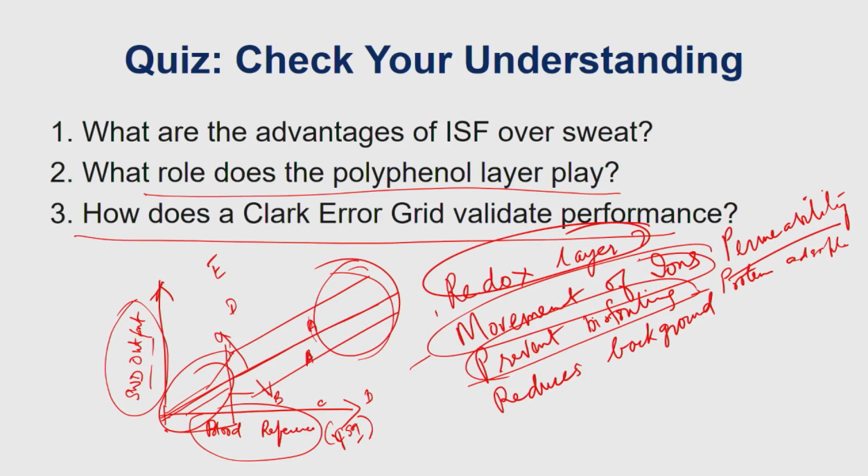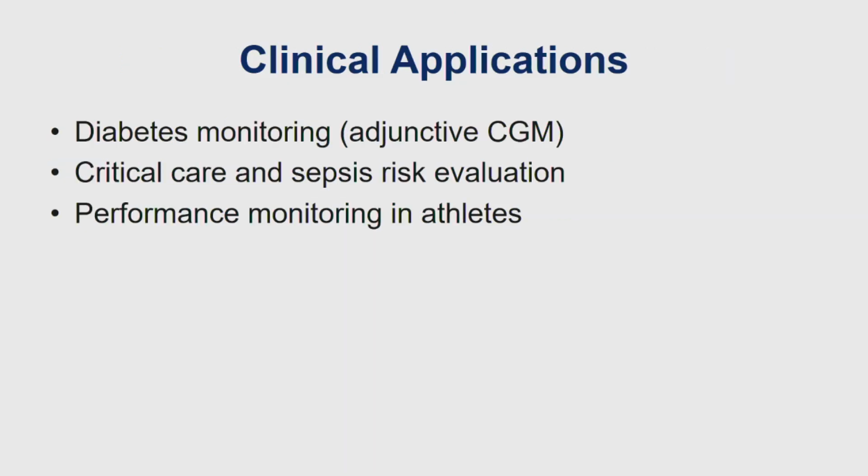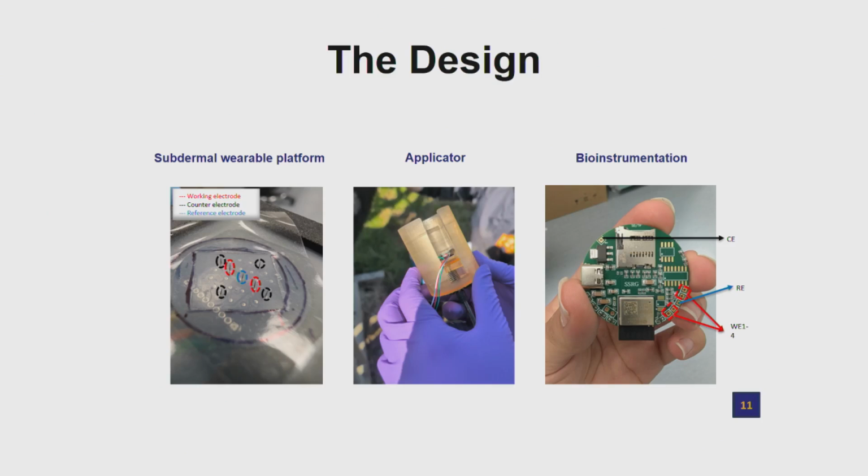Another question: this applicator that you are designing, is it required for microneedles? Absolutely. Is it designed in-house? Yes, this one I've got the design as well. The applicator we've used here is all in-house. What we're trying to do now is use a PCB disk. I showed you previous studies where we spoke about interference from the base if it is fully metallized. So we've started using PCB disks with our acupuncture needles soldered onto them, and then we have the wires and everything, and on the back of it is going to be similar to what we have.